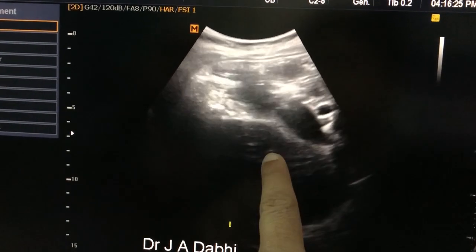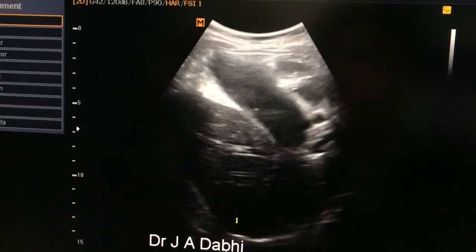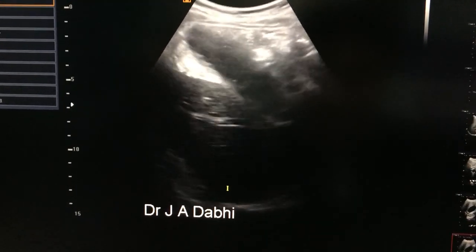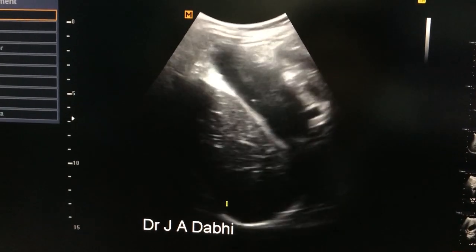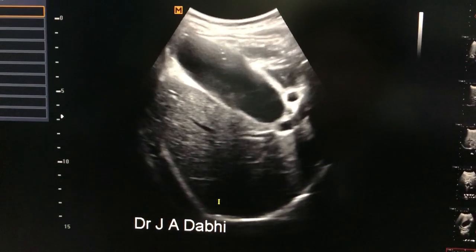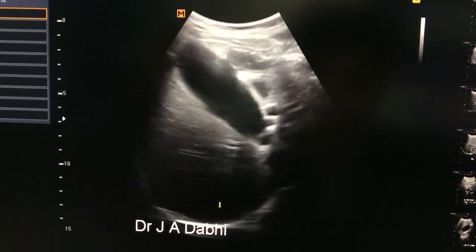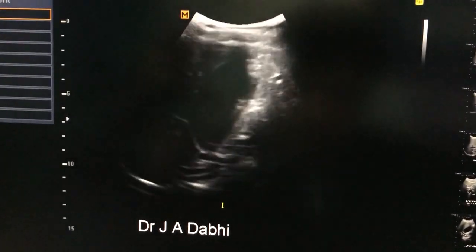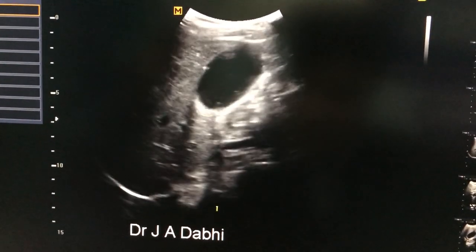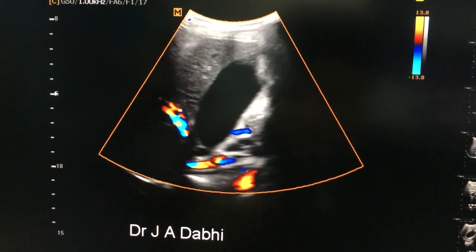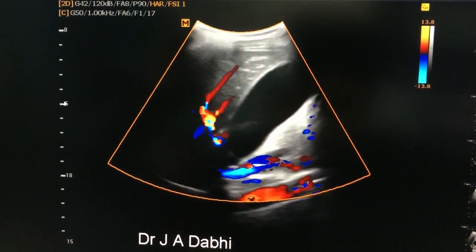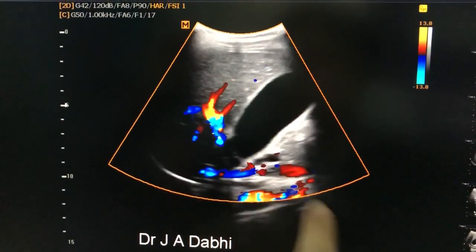This is the over-distended gallbladder. As we can see subjectively, the gallbladder lumen is quite increased in size. If we apply the colour flow, this is the gallbladder in longitudinal view.